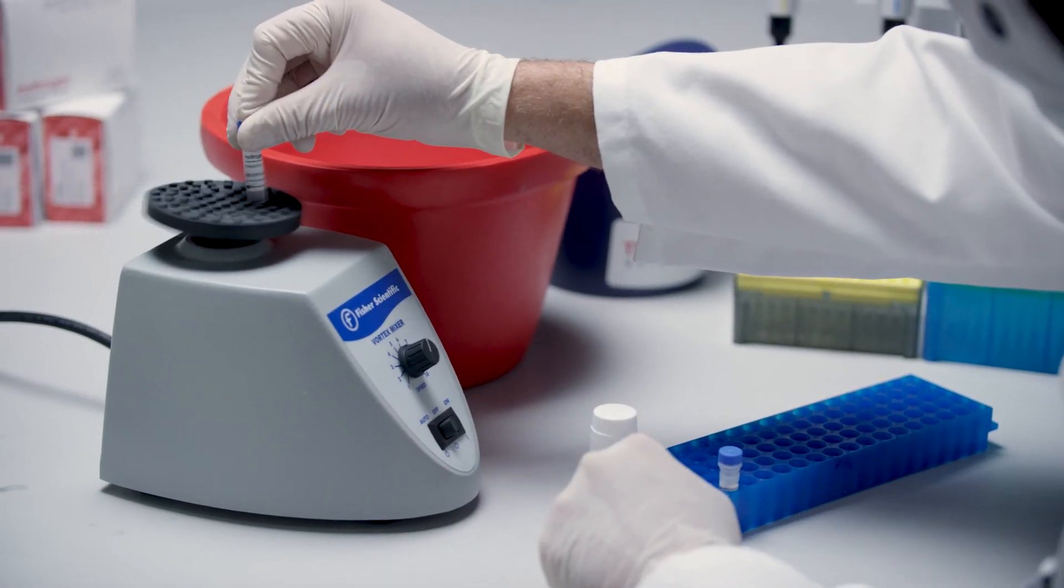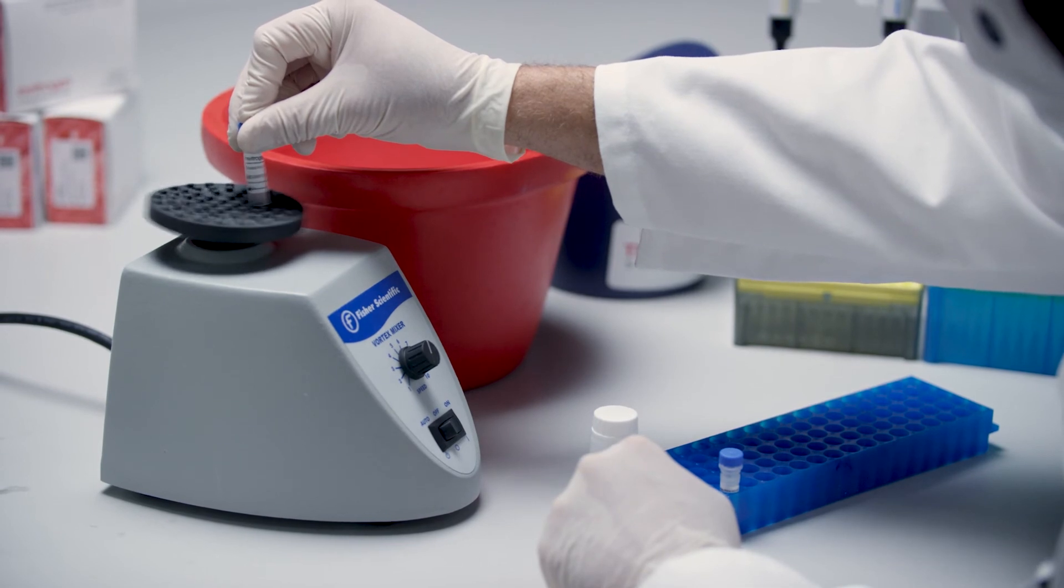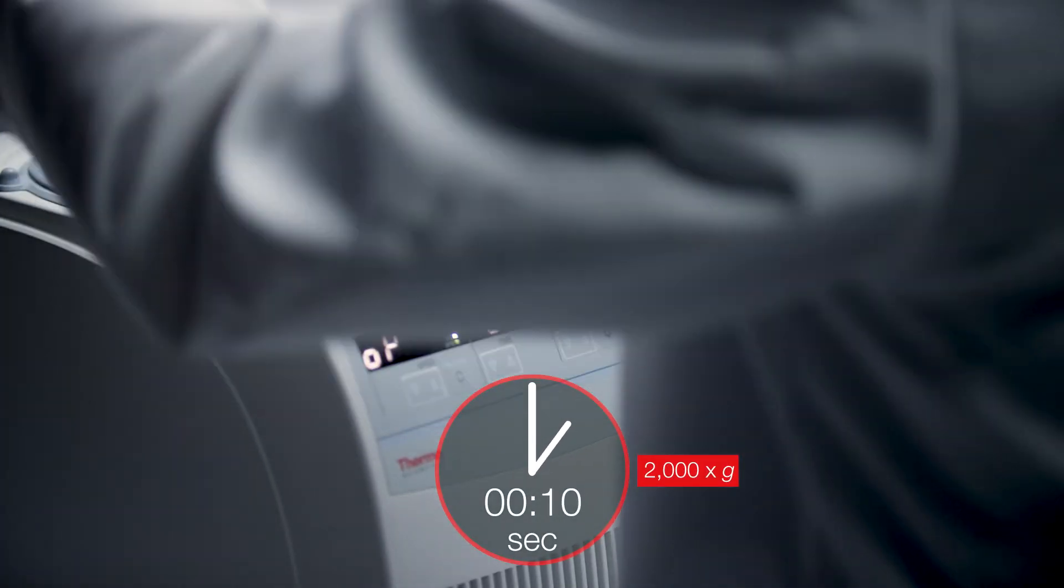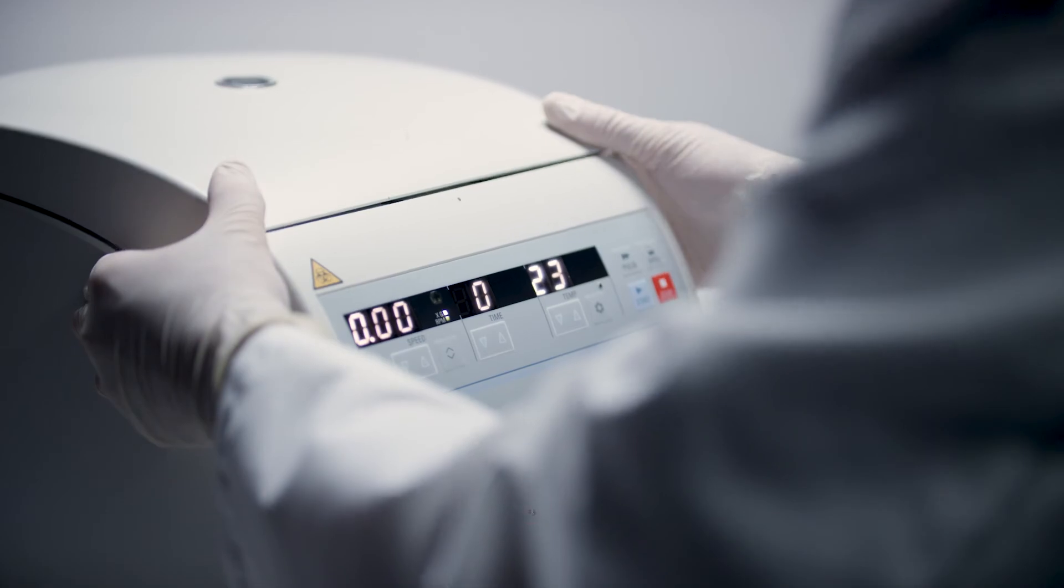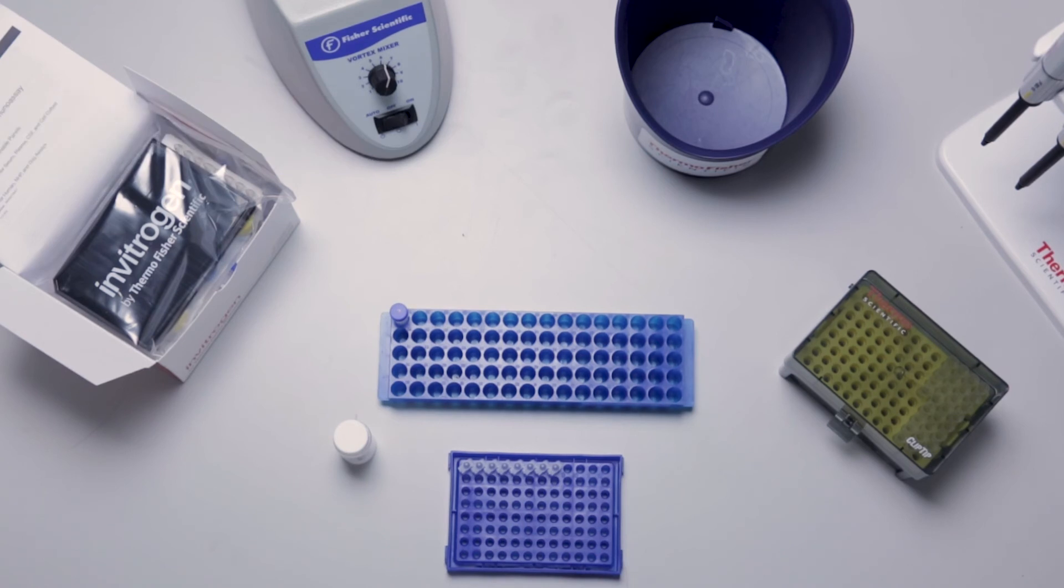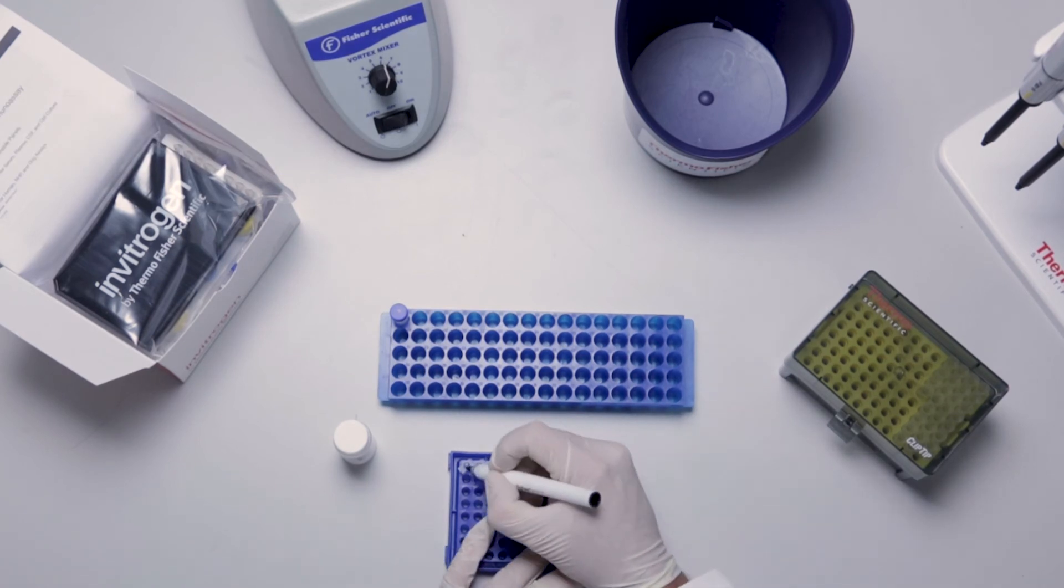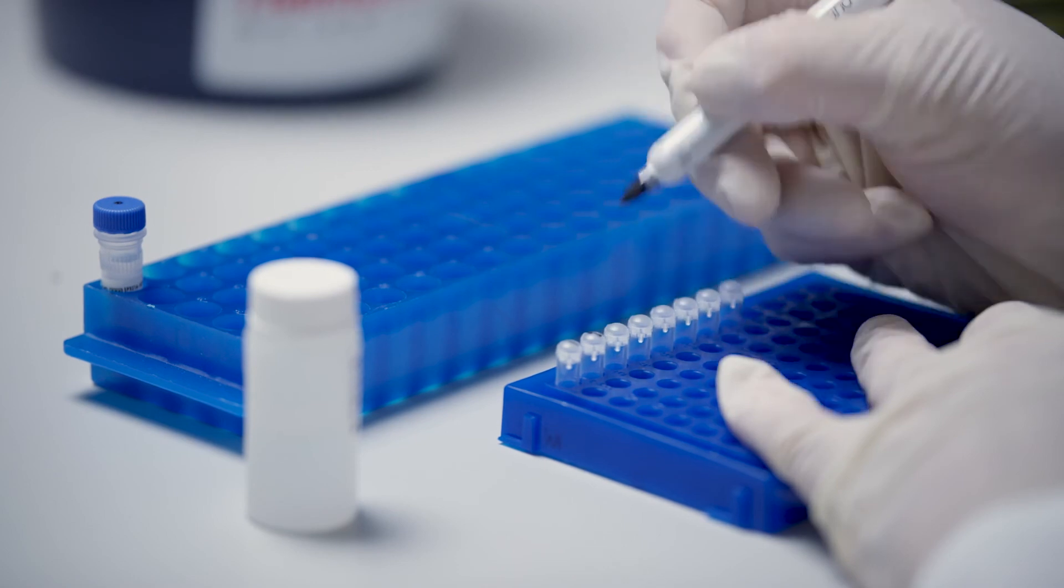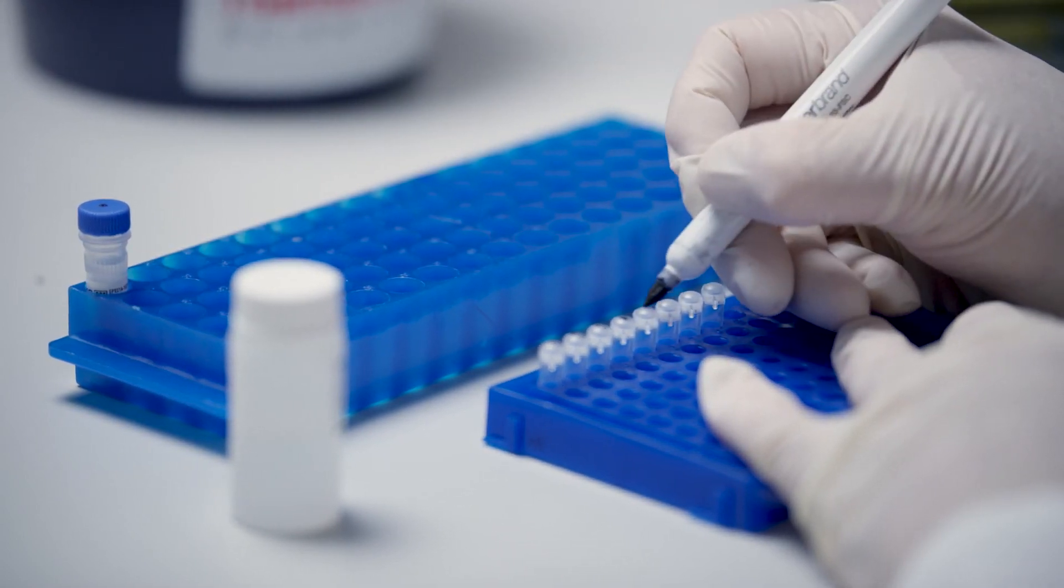Vortex the working antigen standard vial at high speed. Centrifuge at 2000 g for 10 seconds. Prepare a four-fold serial dilution of the working antigen standard vials using the eight-tube strip provided. Label tubes sequentially standard 1 through standard 7. Label the 8th tube for use as a background.